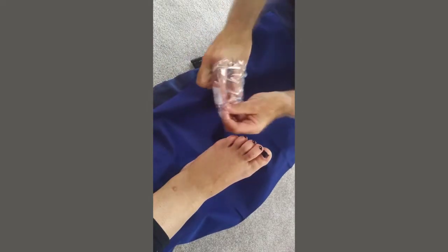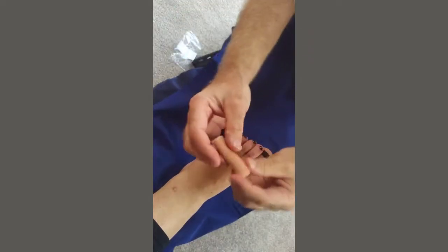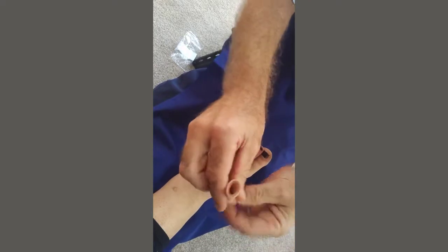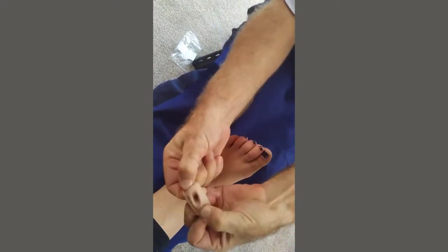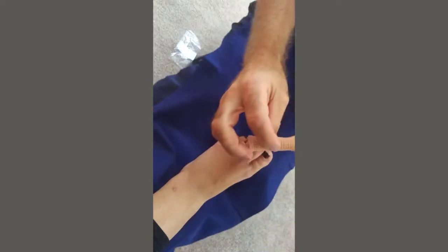If we open it out of its packet, you'll see that it's a soft, squidgy, gel-lined elasticated cap. It's a one-size-fits-all, so it can fit anything from a small toe to a big toe.